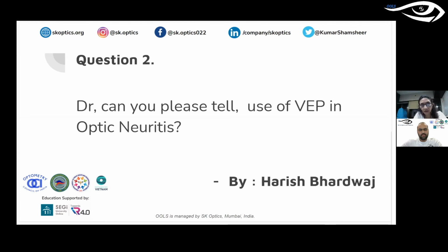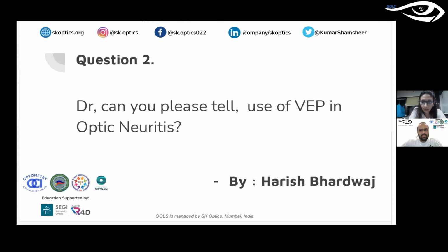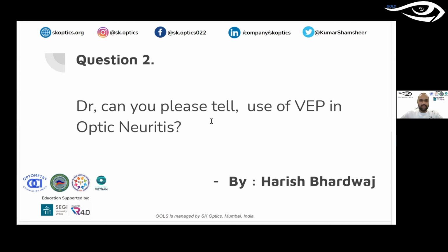There are certain waves which occur in optic neuritis, and they are called the P waves and the N waves. In optic neuritis, one particular wave is stunted in height plus prolonged. When you do VEP, it's diagnostic of optic neuritis. If the N wave is delayed or the P wave is delayed and it's stunted in height, the P100 as it's called, that is diagnostic of optic neuritis. So if you have a confusion, you can do an MRI, you can do a VEP, you can do fields, and all this will tell you whether it is optic neuritis or ischemic optic neuropathy. However, the diagnosis for optic neuritis is now MRI, visual evoked potential and fields. These are the three things which help you diagnose optic neuritis from other conditions.